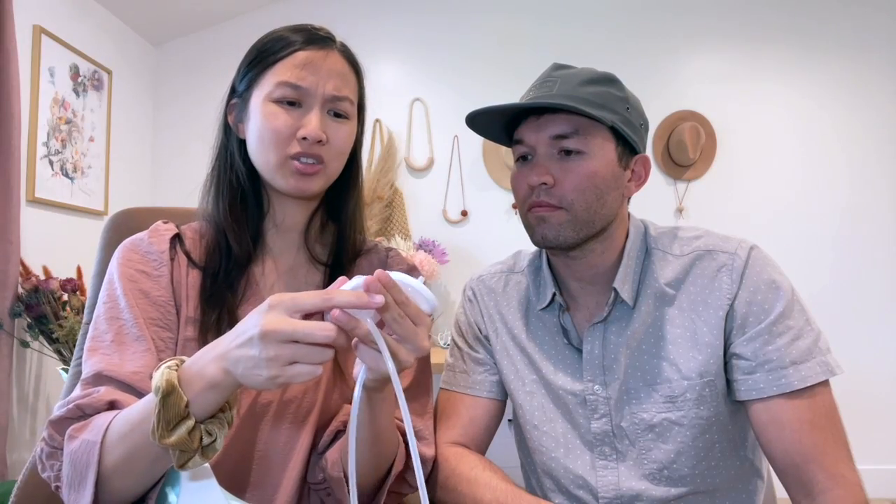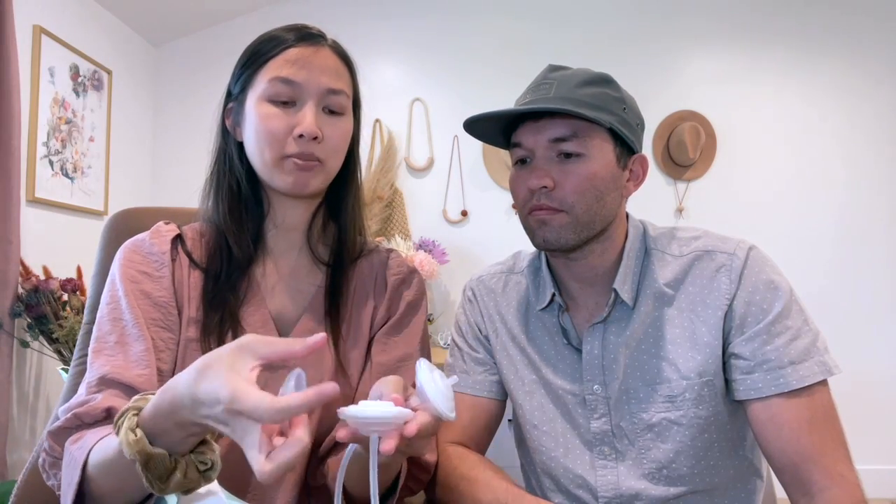They should last at least two to three months, but it really depends on how often you pump. I haven't had to replace them yet, and I've been pumping for about a month and a half, but I'm getting close.